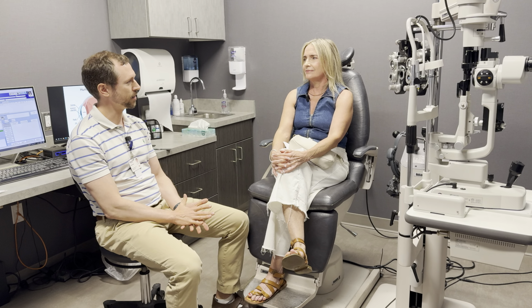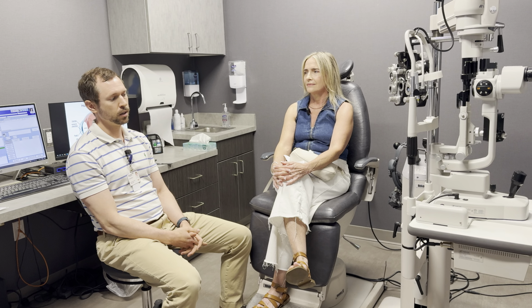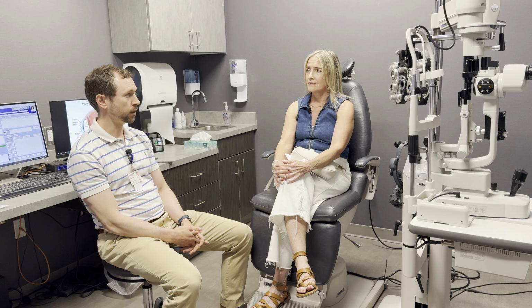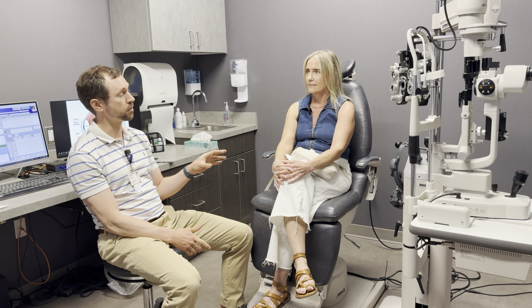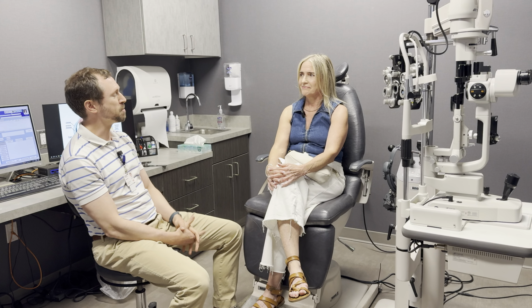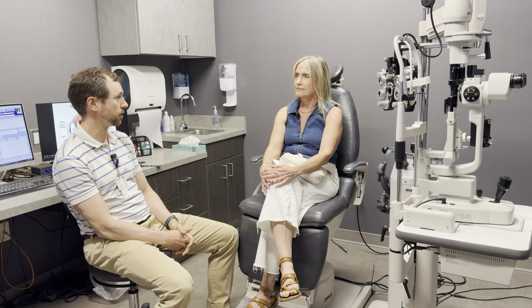I love it. One other thing I'll say, I think particular to the Odyssey lens, if you dig into the data with its clinical trials and data that's been put out about the Odyssey lens, it tends to be a little bit more forgiving with slight refractive errors, residual glasses prescriptions, which sometimes an RK patient is going to be more prone to having. Well, in the Odyssey lens, patients tend to still be 20/20 even with modest refractive errors. Now that's not true for everyone, but I think it's fair both in the company's data as well as in my experience. And by the way, I have no financial interest with this product other than I benefit from happy patients, maybe you could say, but I don't have any relationship with the company that makes this product, but I do happen to like it.